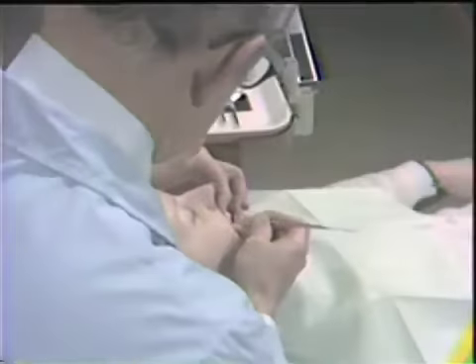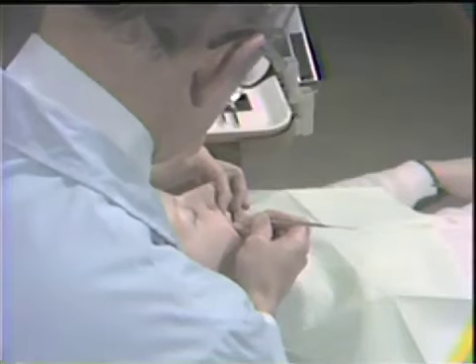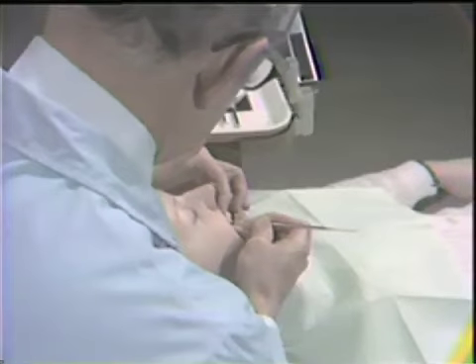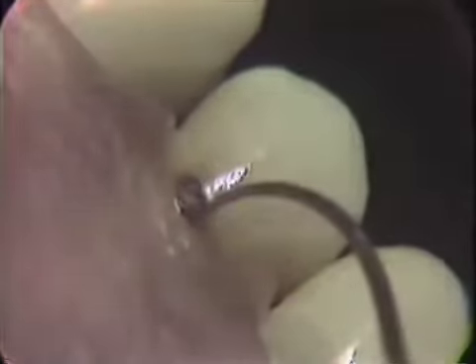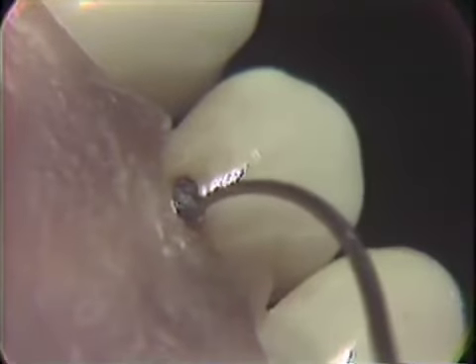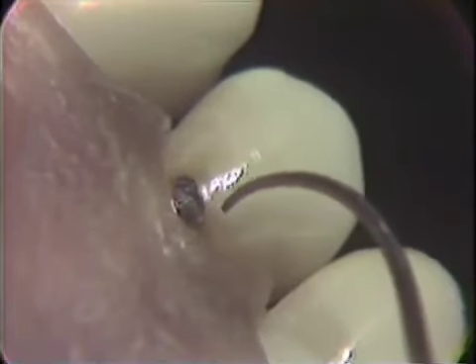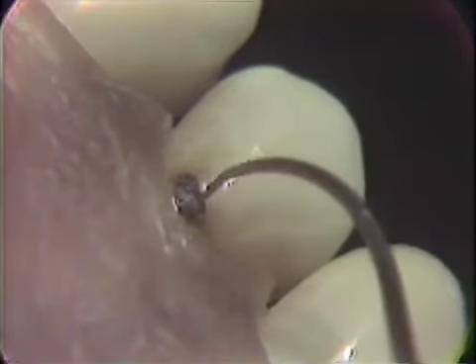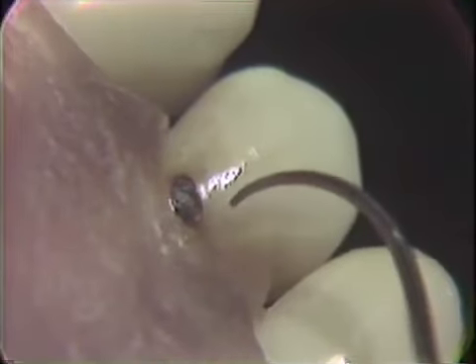And as I'm viewing this now, sitting in the operator's position about 11 o'clock, we see that the carious lesion is just supragingivally. It's a lesion that is at the cemento-enamel junction and down into the enamel. We've got to consider, of course, the isolation of this site in order for us to do the cohesive gold.